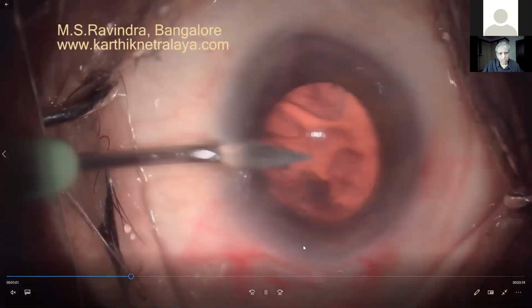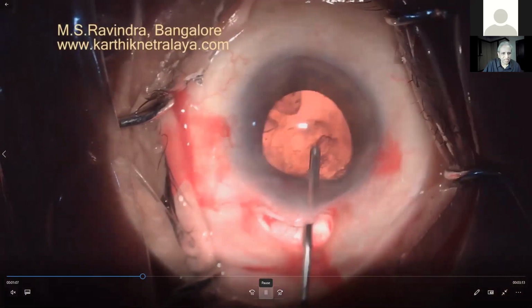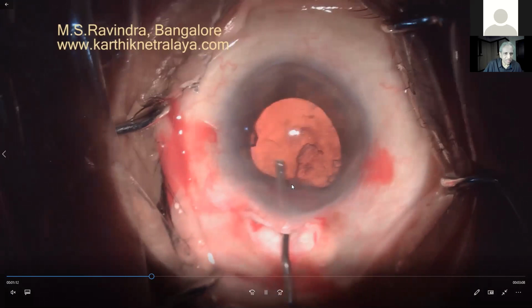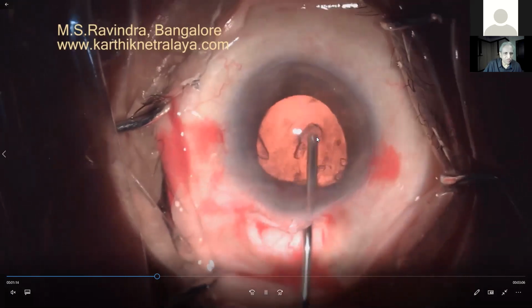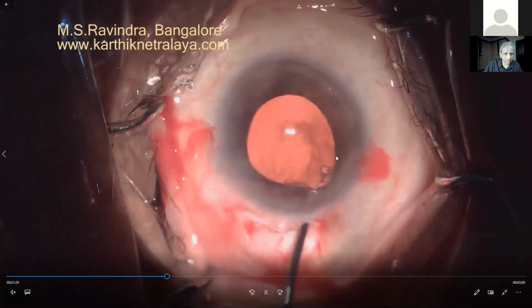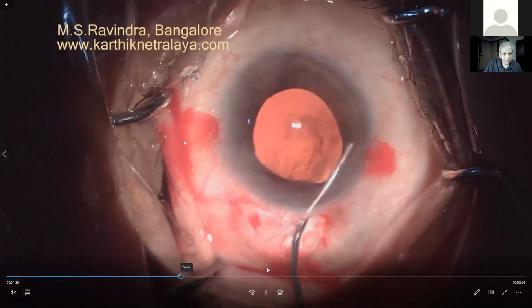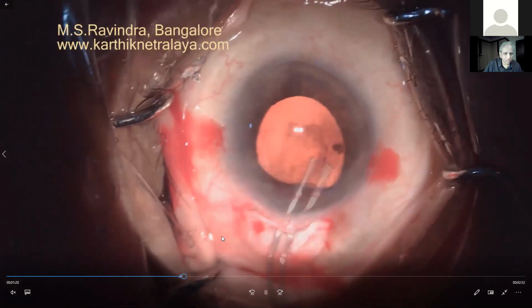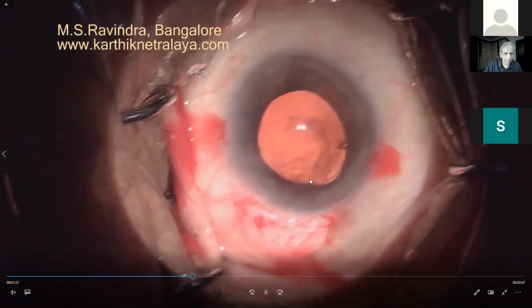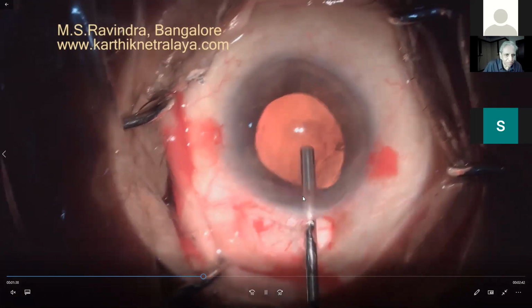I'm preparing myself to put the iris claw lens here. Very gently. You can see, in spite of the vitreous being there, and if it's not admixed with cortex, you can always do a limited vitrectomy and guide these things to float out of the eye. I formed the chamber. So you can see the pupil eccentric here, pupil dragged out there. There is an amount of vitreous in that area, as you can see here. You can see the capsular tear.